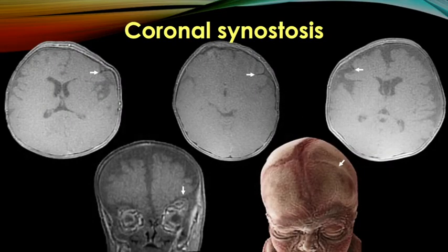Here now are several patients with unilateral coronal synostosis. So you can see this abnormal trapezoidal head shape with premature fusion of the single coronal suture, and then the remaining sutures are patent. On the coronal image, you see that characteristic harlequin eye with elevation of the superolateral orbital rim. And you can even do 3D reconstructions to look at the narrowed and early fusion of that coronal suture.